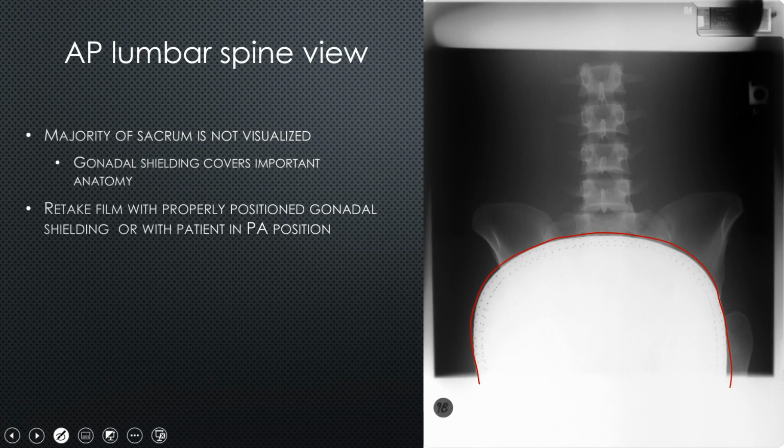Also, just to make note of this lumbar spine, this is not of a human. This is known as a phantom study. So it's a model of the lumbar spine. So if you're looking and counting and saying, oh, they're missing a couple pieces, that's why it's called a phantom or just a model spine. So that's what we're seeing here.